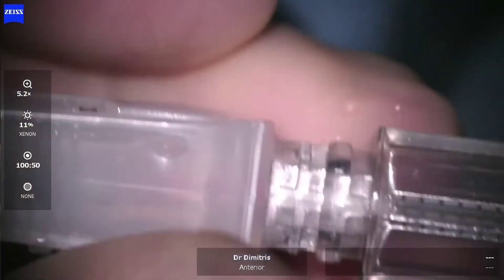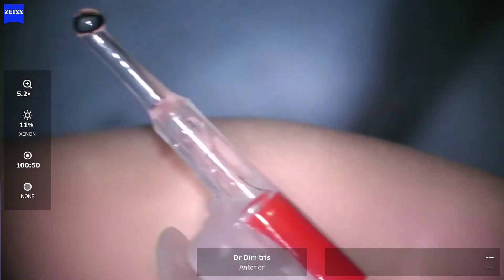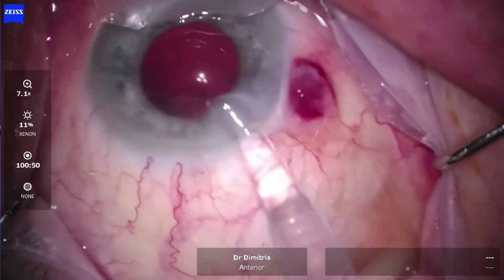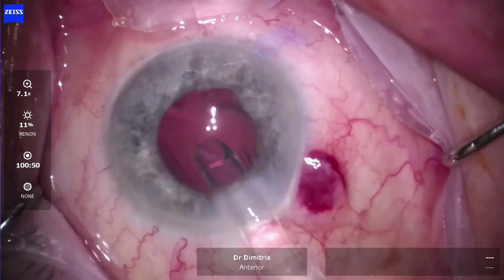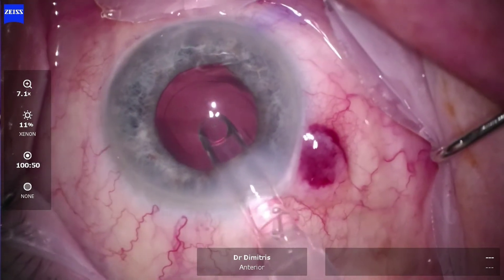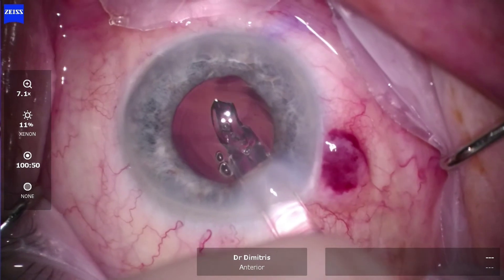Turn the injector around and initiate a gentle push to see the lens move safely in the cartridge by the orange stopper. We're now ready for the IOL injection through the small 2.2mm cartridge nozzle into the eye, and observe the smooth, safe and secure lens unfolding into the capsular bag.